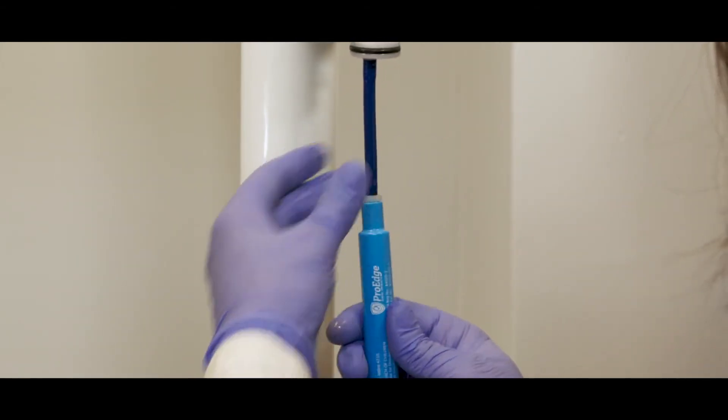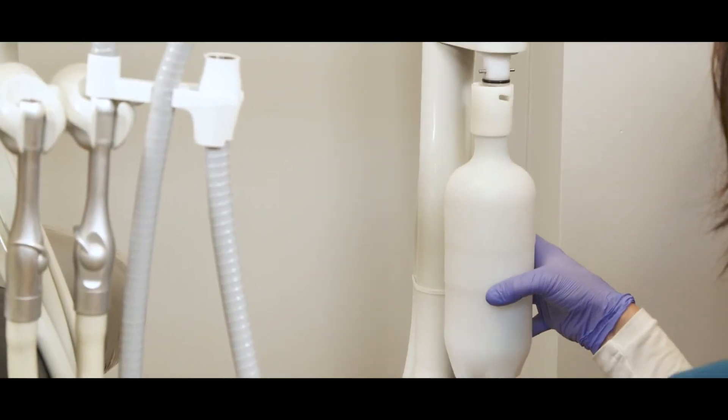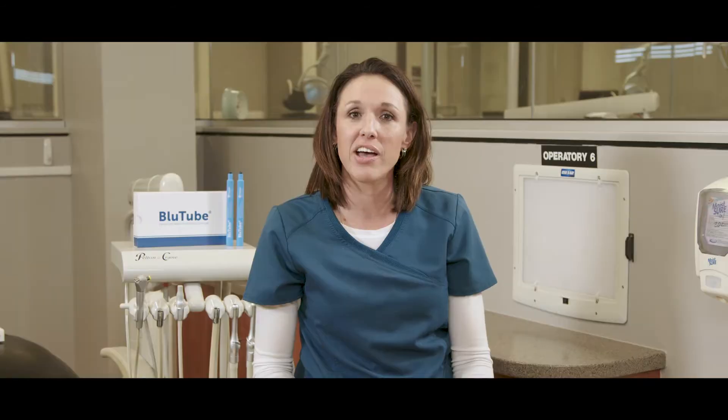Now you're ready to connect the blue tube. Simply insert the blue tube utilizing the attached luer lock, and reconnect the water bottle. Set the pressure to 45 PSI and operate the dental unit instruments until all air is purged from the system. With your blue tube installed, Kelly B is going to show you one last thing blue tube comes with to make your life easier.